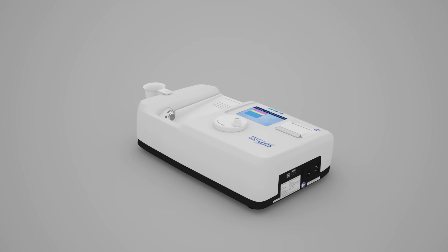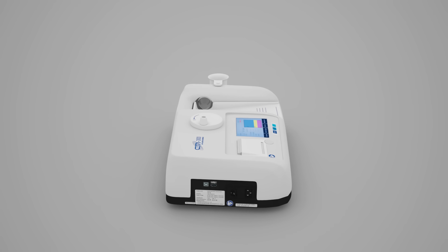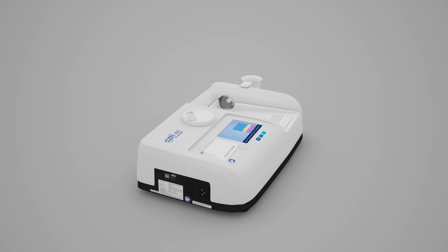Ultrasound bone densitometer measures bone density of the human heel using ultrasound. The CM300 is the most suitable for screening tests of osteoporosis.